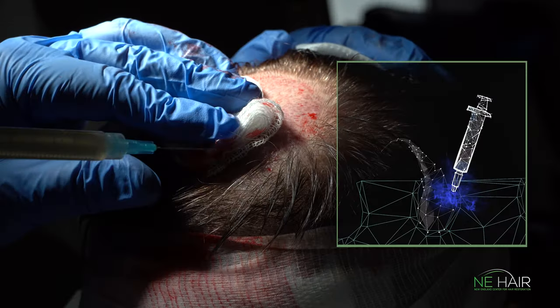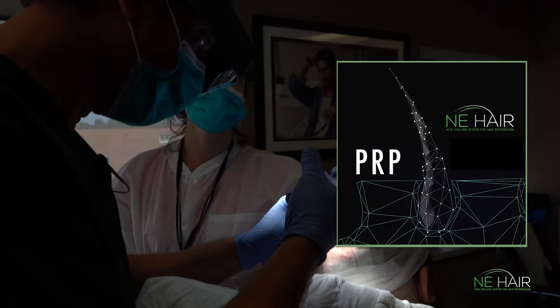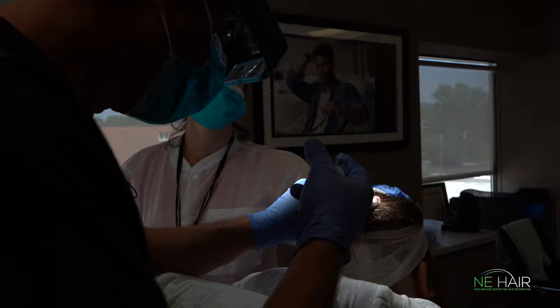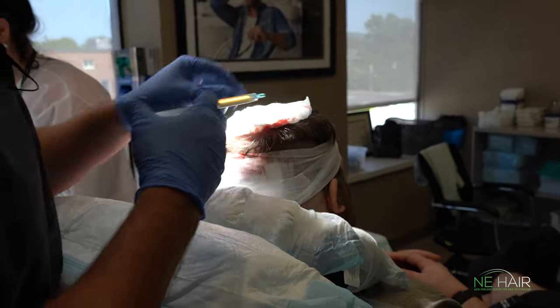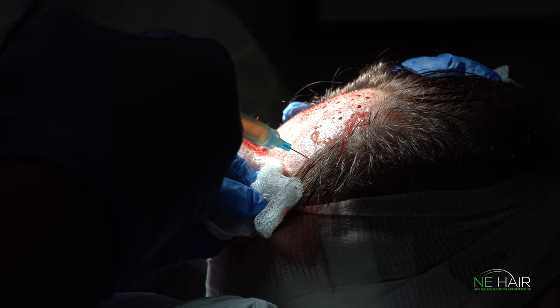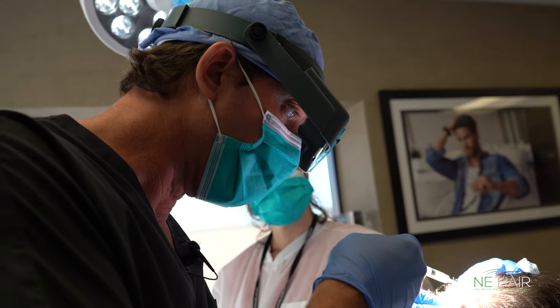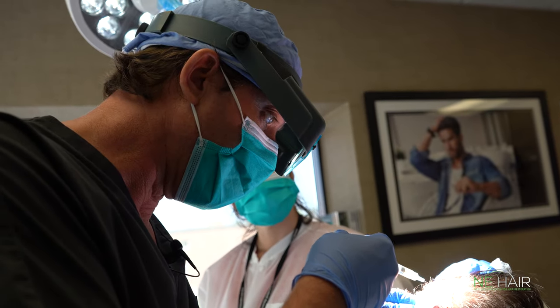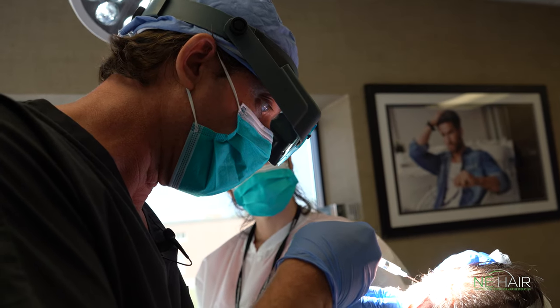In the meantime, we're going to give him some PRP. PRP is injected at about a four millimeter depth, right under the epidermis. This will help the graft survive better.